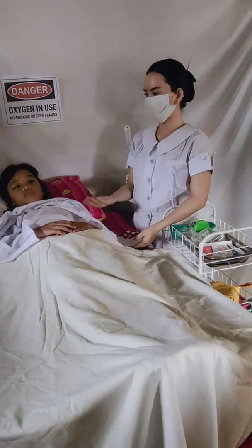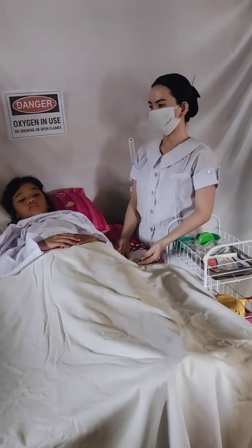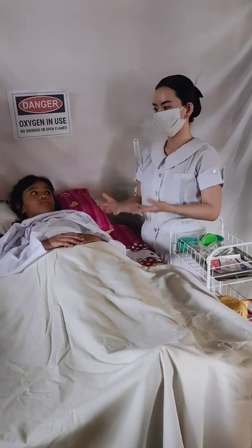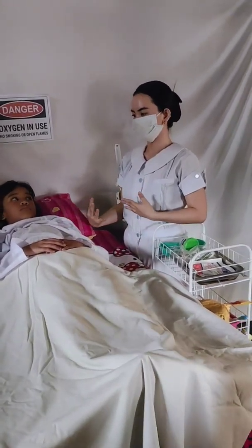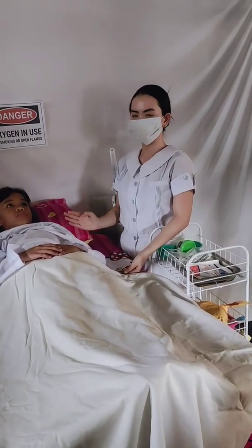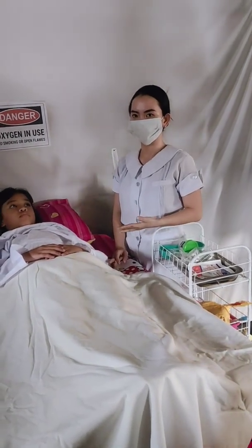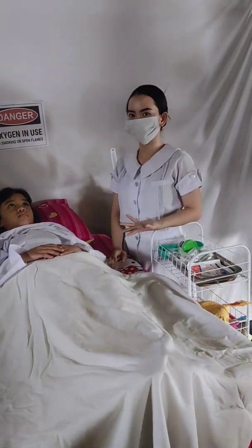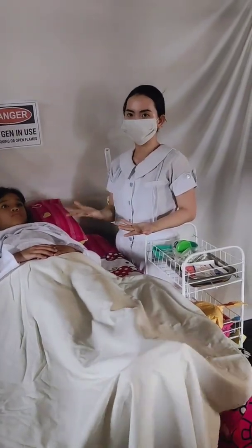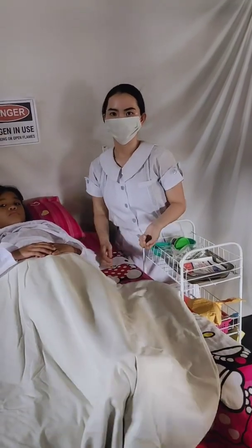After that is introduce self, verify the client's identity and explain the procedure. Introducing self will establish rapport. Verifying the client's identity is a way to know if we are handling the right patient. Explaining the procedure and the purpose of the oxygen therapy to the patient and family will give them an idea of what we are going to do and the reason why we are doing this procedure, and of course reviewing safety precautions necessary when oxygen is in use.